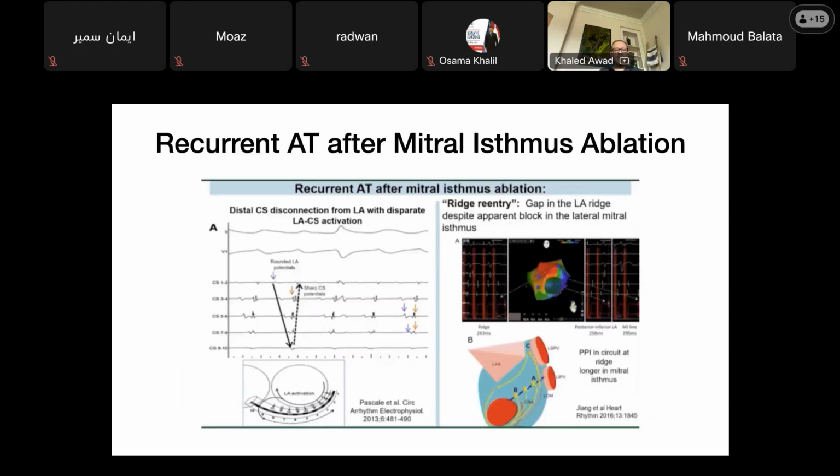There is a very nice paper that was in Heart Rhythm just in the past month or so, just taken this to extreme elaboration on that particular syndrome. And it's sort of helpful to recognize the different patterns of that. It is very simple. The principle is if you make a line, you got to finish it. You got to get the endocardial and epicardial aspects of the tachycardia.